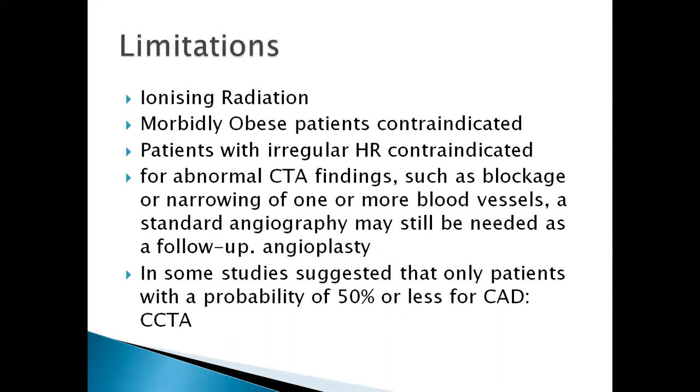Just like any other examination, other modalities in the radiology department, the cardiac CT angiography also has limitations, in that first it uses ionizing radiation. So we know that pregnant women may not be able to go through this.